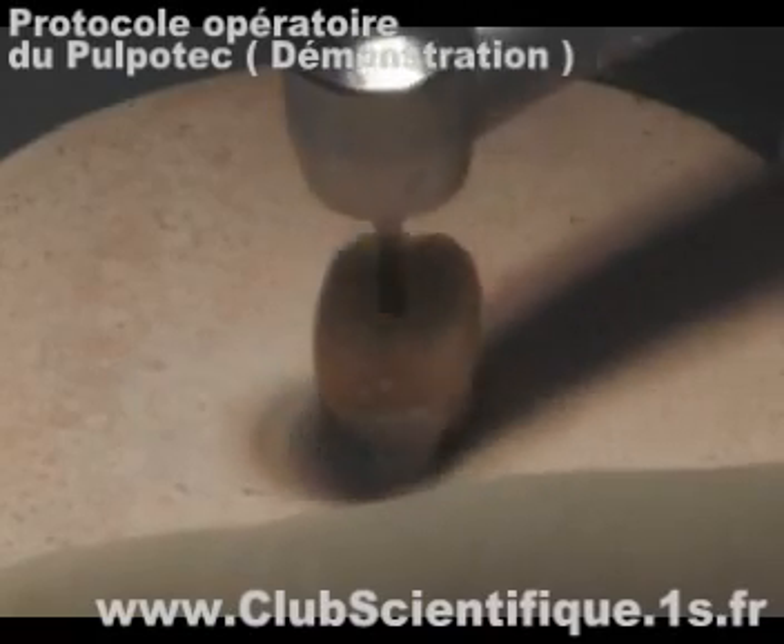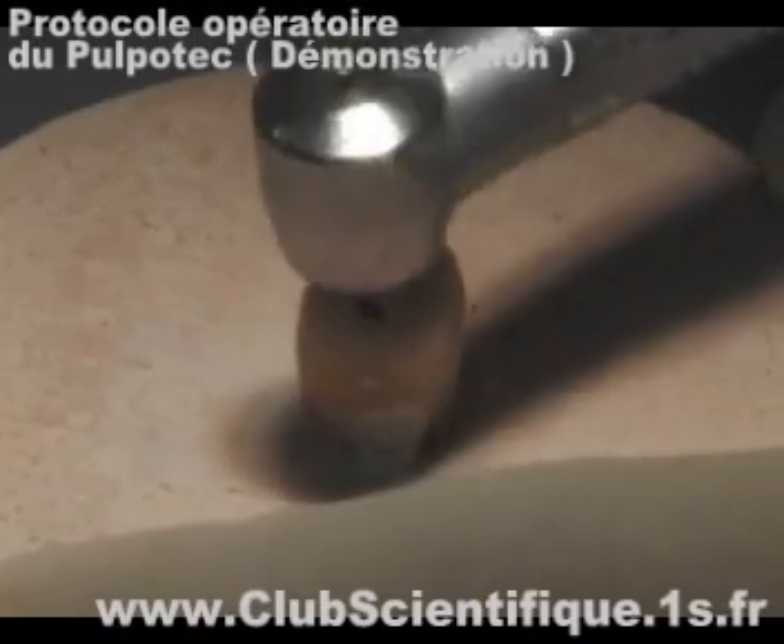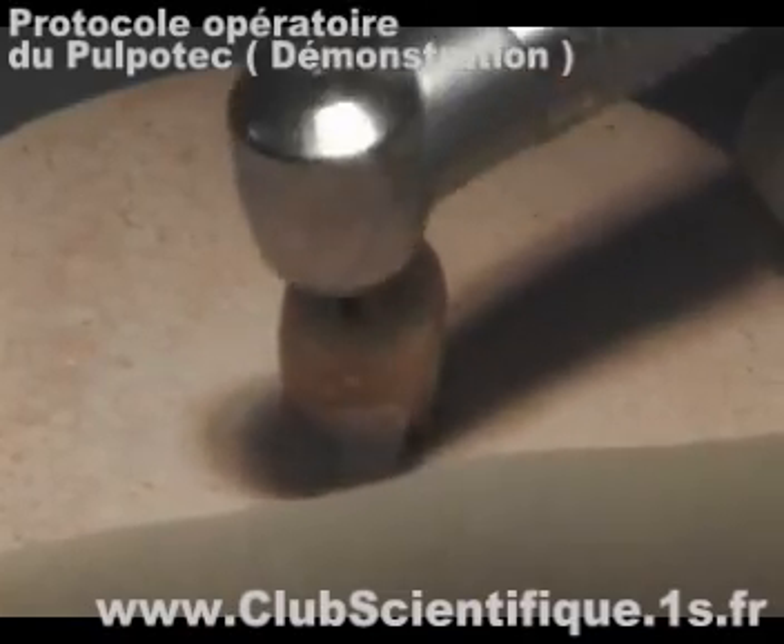It is of utmost importance to use high-speed rotary instruments to carry out pulpotomy in order to avoid tearing the pulpal fibers of the root canal.